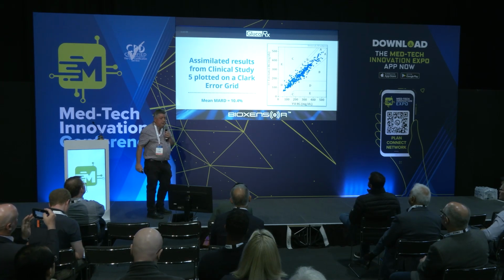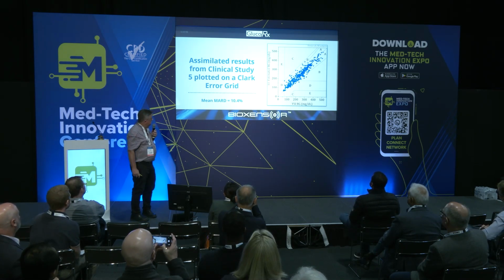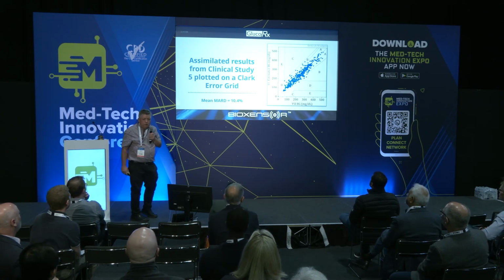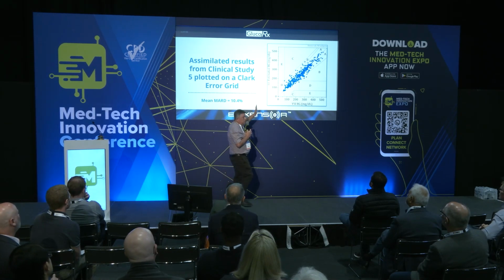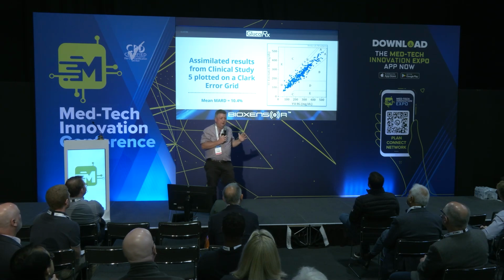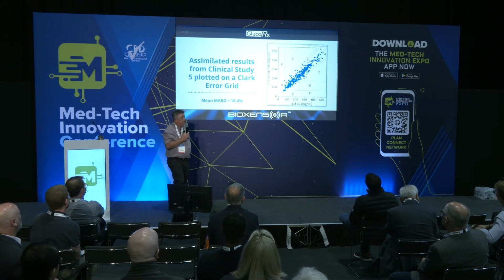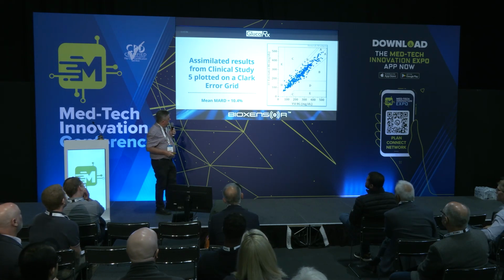If you put these on the conventional grids that are used for correlating blood glucose readings for such sensors, you've got something called a Clarke error grid, where you're basically plotting your measurement vertically of glucose concentration against that of the gold standard. And of course, if you get the axes right, that should be a straight line through the origin, a 45-degree angle, and we sort of get that, the scatter in that data. This was a 50-subject trial, but there's nothing there to cause any major concern.